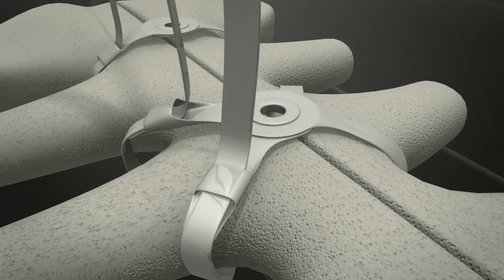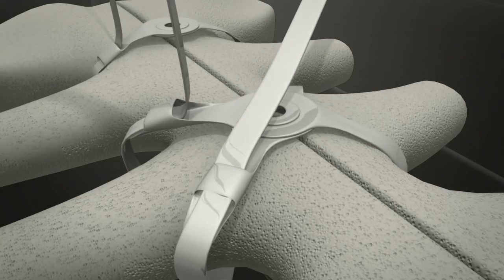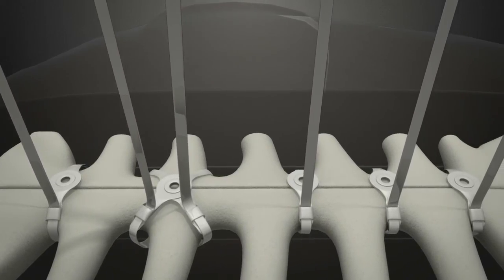At this point, the closure is reversible by simply bending the straps back down to 0 degrees and loosening. When satisfied with the closure, the final security is performed.